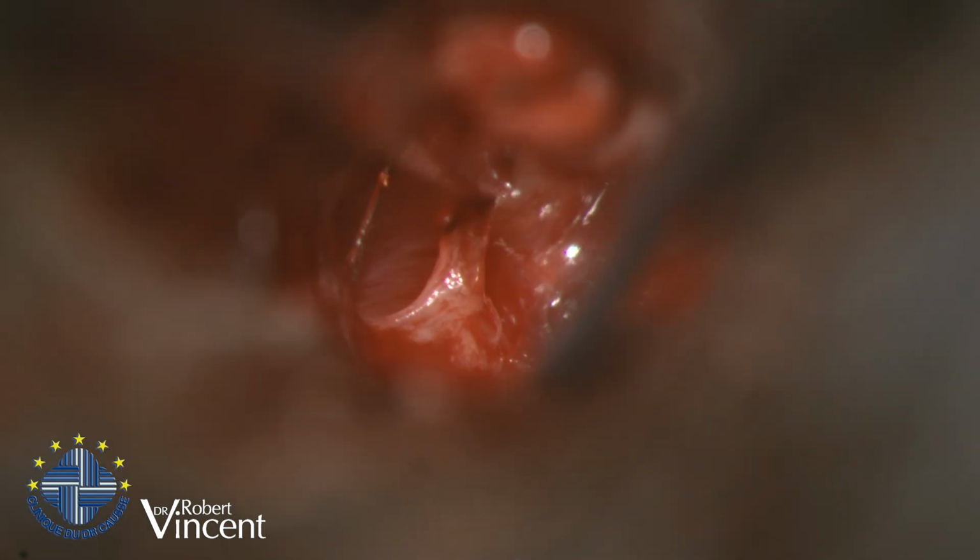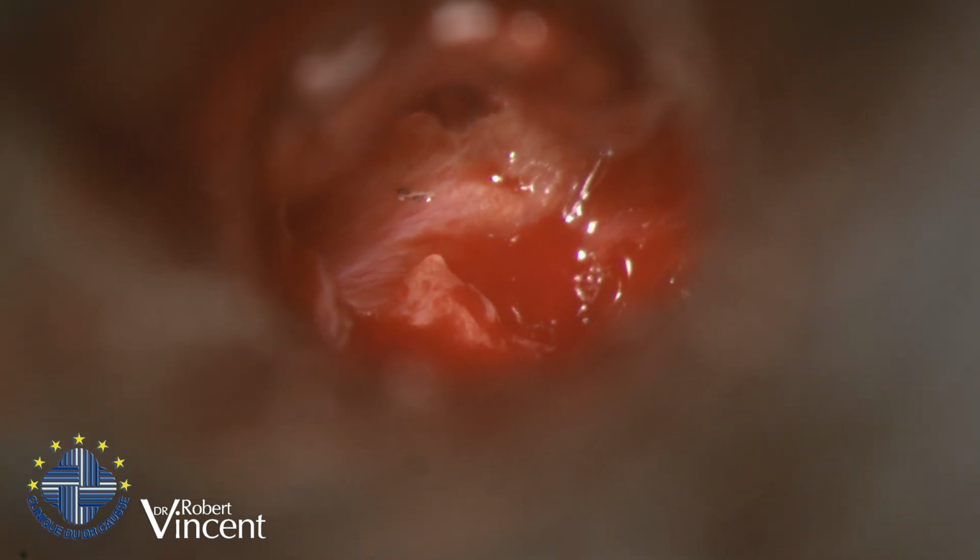Plus a torp. Again, some adherence there. Ciseaux. Okay, so now I need to work on the oval window to identify the footplate. If there is some fibrous tissue, I try to make a gap within the fibrous tissue, in order to introduce the distal tip of the shaft, holding it.